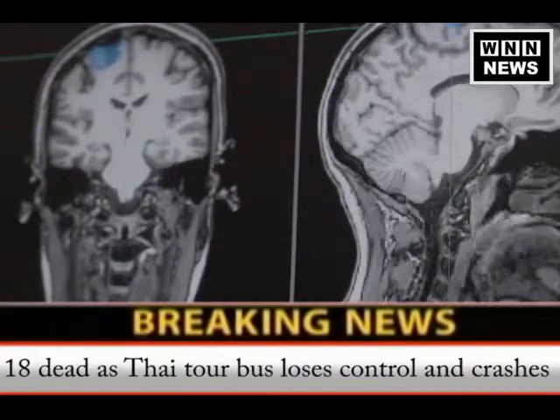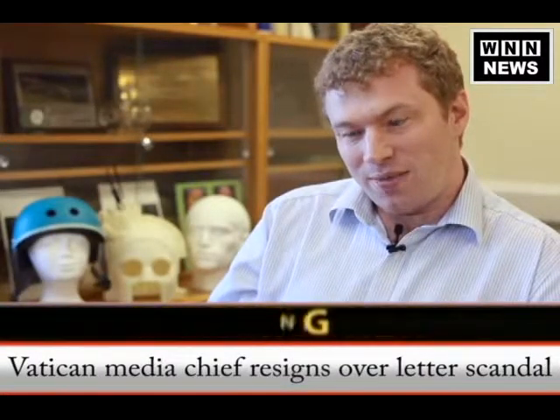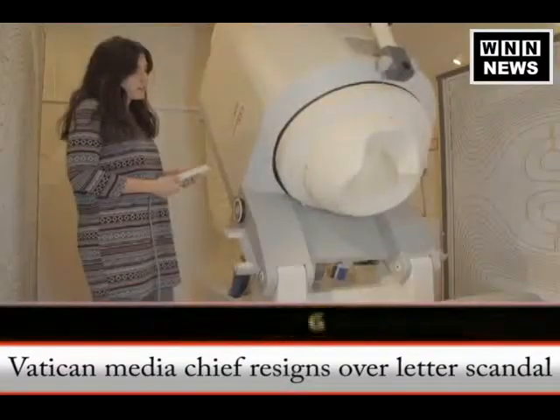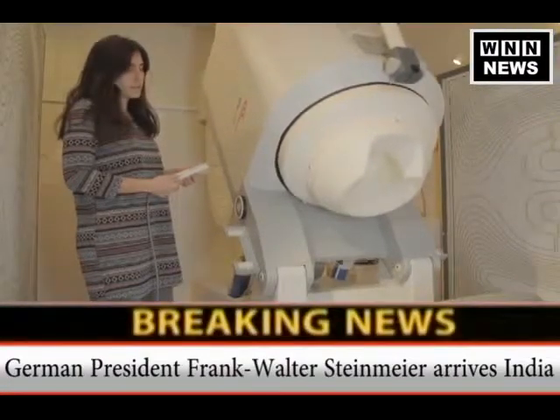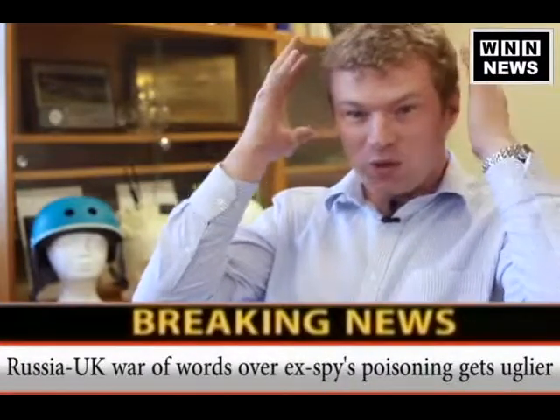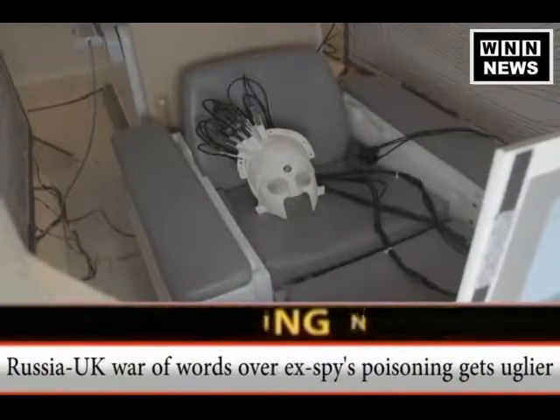The problem with current MEG scanners is that they're very large, they're very bulky, and they're one size fits all. The gap in the market, if that's the right expression, is for a scanner which you can wear on your head. So you put it on like a helmet, you can wear it on your head whilst we're acquiring brain imaging data.